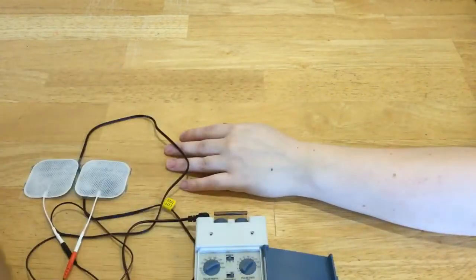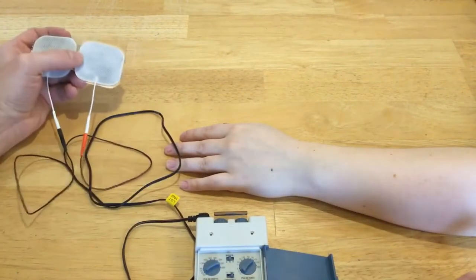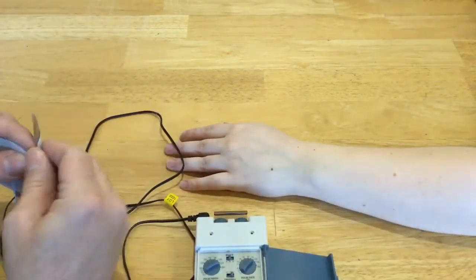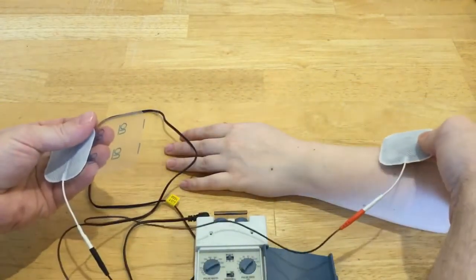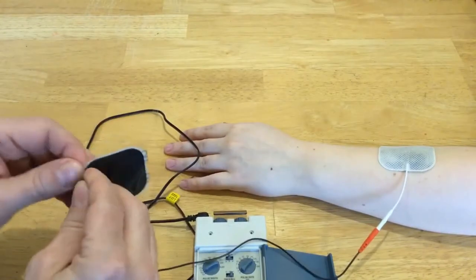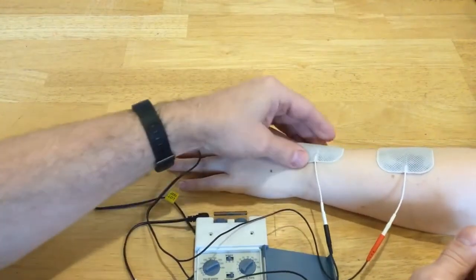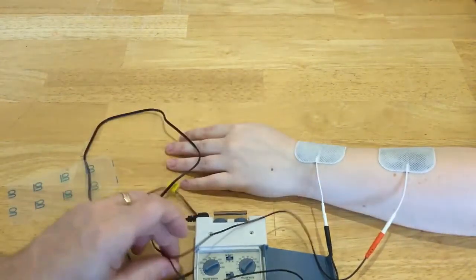Okay. Once we've done that, I'm going to pretend that my client has intersection syndrome, which would be pain right in this area here. And basically you want to surround the area of pain with your electrodes with conventional TENS. So I'm going to apply an electrode proximal and an electrode distal. As far as your electrodes, you generally just want them to be at least an inch apart and then well adhered.